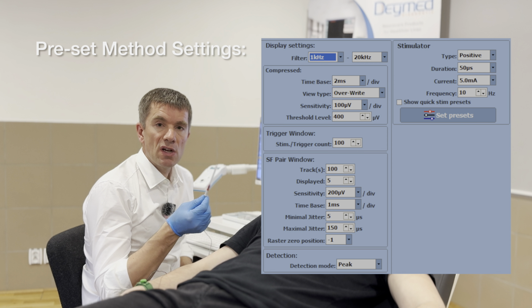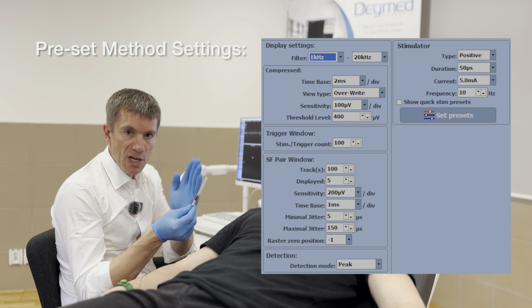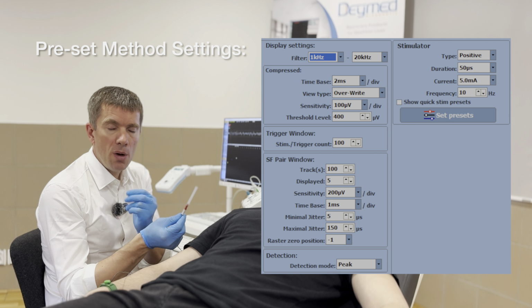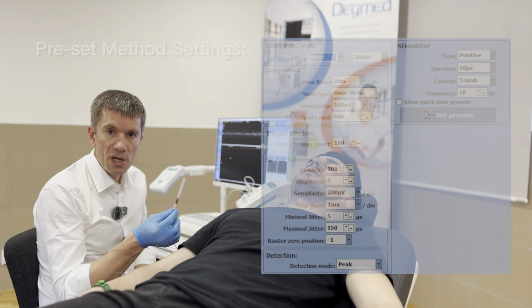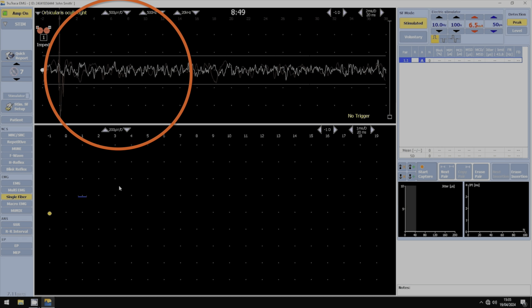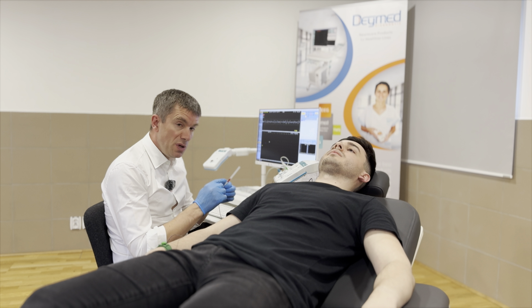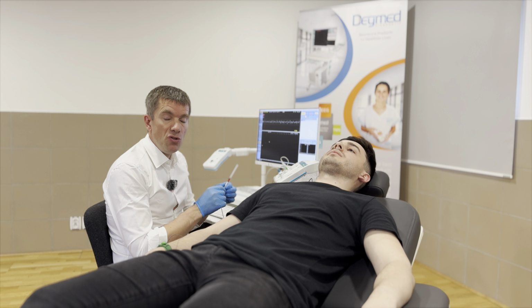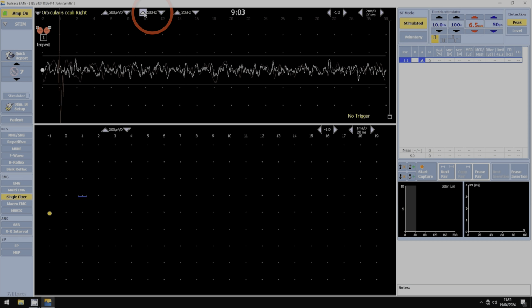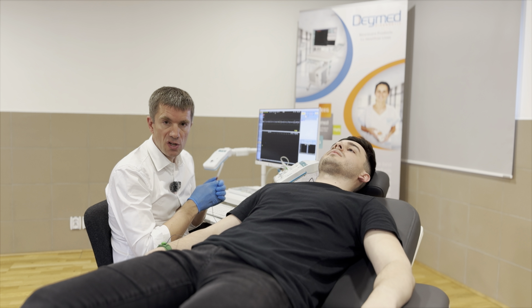In fact, in stimulated single-fiber EMG, a pair is constituted of our trigger, the stimulation trigger, and one muscle fiber. So this is not a pair of two muscle fibers that we are recording. As you see on the screen on top, we will get our stimulation artifact as well as the muscle activity. But very important is that as we use a concentric needle and not a single-fiber EMG needle, we adjust the filter settings. The high-pass filter should be elevated to at least 1 kilohertz using this concentric needle.